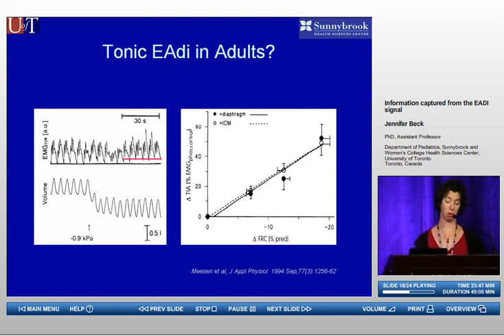We have observed, I think in 1 or 2 patients with ARDS, that when you reduce the PEEP, there is a slight increase in the tonic activity of the diaphragm. But it's not something we see all the time. It's not as systematic as we see in the rabbits or in the babies.